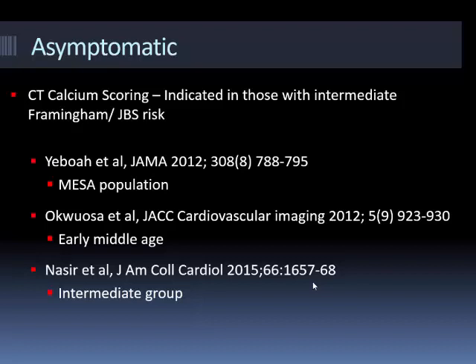I think in terms of your calcium scoring, there's more and more data to suggest that calcium score is a very useful adjunct to the traditional cardiovascular risk factors. In other words, where it can be particularly of use is in the intermediate group. If you look at people's cardiovascular risk based on traditional risk factors, you may find that on the basis of being in the intermediate group, they may not require therapy, but rather they should be undergoing things like dietary changes and also lifestyle modifications.